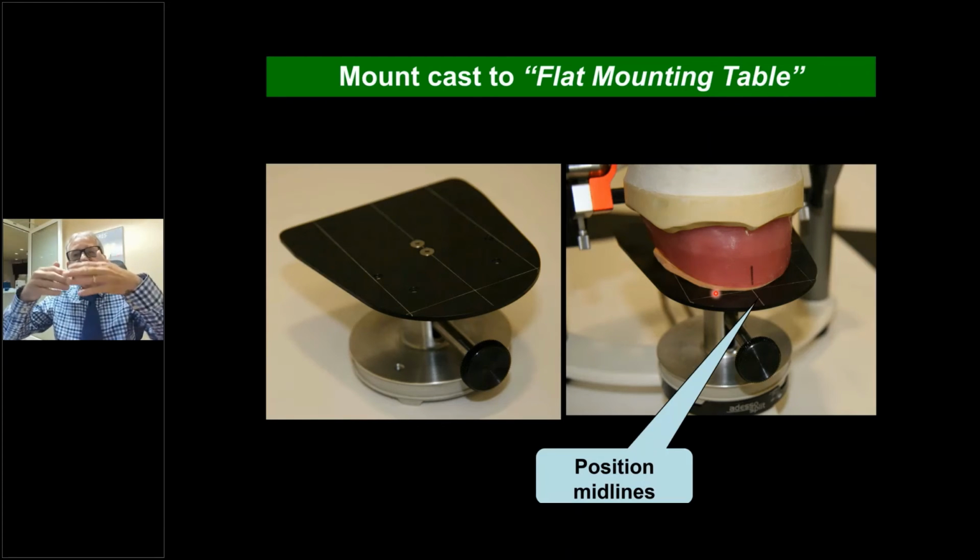I don't have anything to make sure I don't pull them out, pull them back, or that I get leaning left and right. So this little bitty setup plate is absolutely a necessity to make sure the teeth always get set properly, labially, incisally, and you don't have it leaning. I really like the way the plates do.